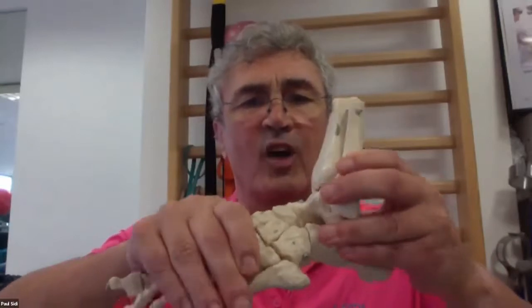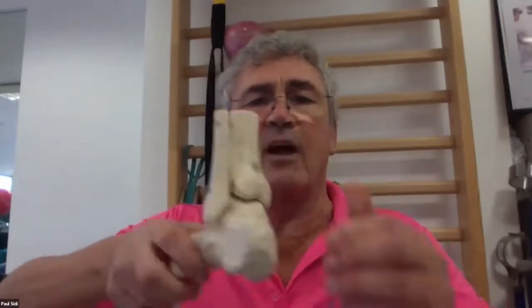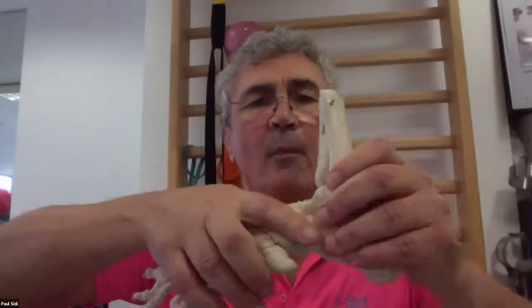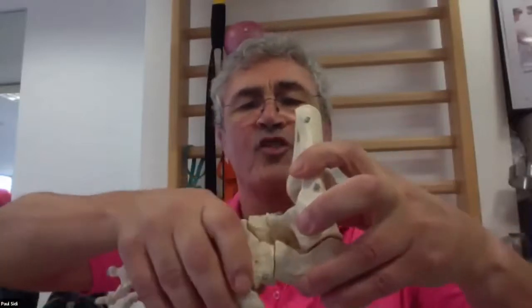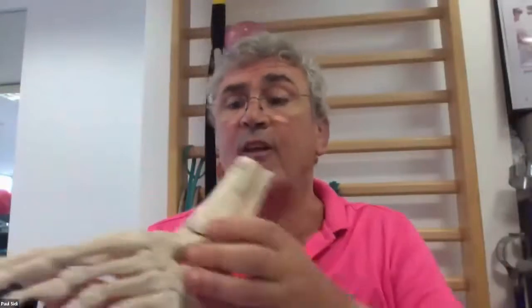Now, there is a little test we'll show you afterwards how to check if the foot is locking or unlocking. But certainly in calcaneus neutral slight eversion, this will move really quite massively. You'll see it's different. When we come into inversion, it should lock it slightly. And if it does, we know that we've got fairly good locking of that midfoot. You'll get some people where you bring them into inversion, and then you start moving this, and it's still flying all over the place. They have a problem coming up because when they're loading this all the time, this whole area is moving massively, at different times, different sorts of pain all the time, and we get problems.